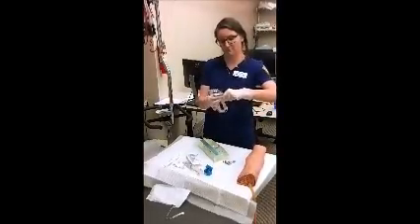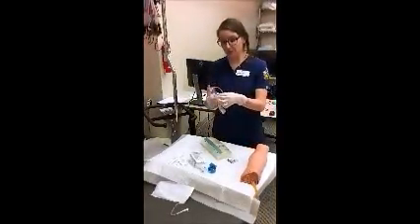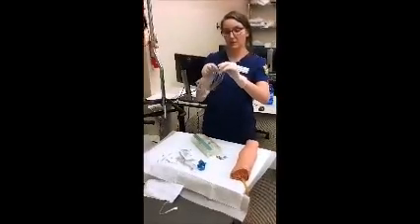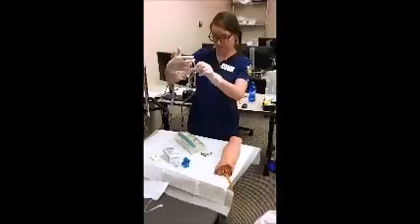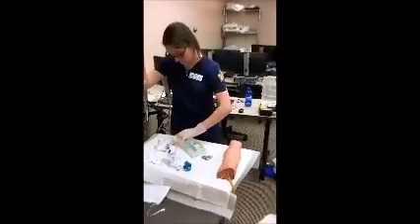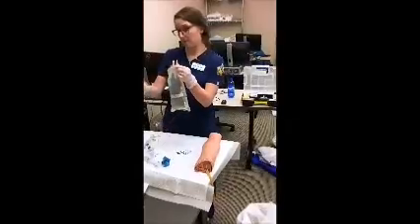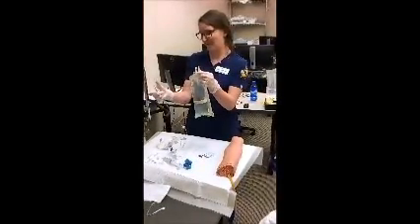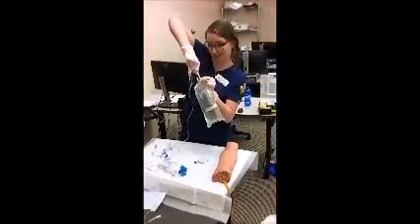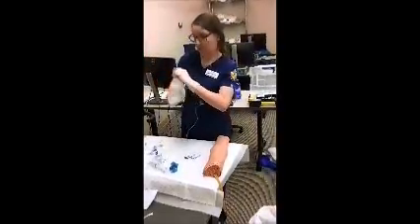So we'll go ahead and open this up. I'm going to close our roller clamp to prevent a mess, and then I usually like to pinch this one too, just in case. Go ahead and locate our spike here. And we're going to maintain sterility at all times. Pop that off. We're going to go ahead and screw that in there, making sure that spike is in there nice and firmly. And we'll go ahead and hang this up.